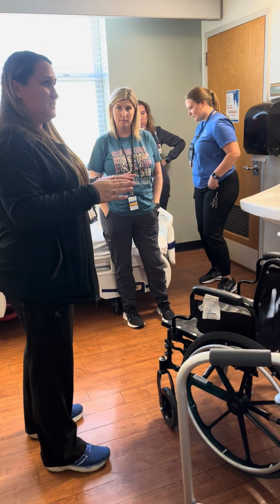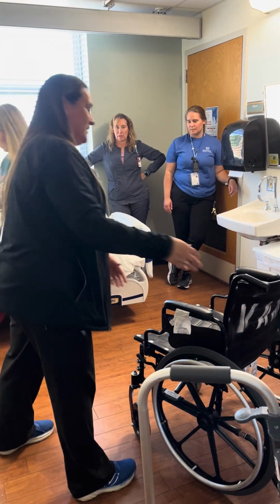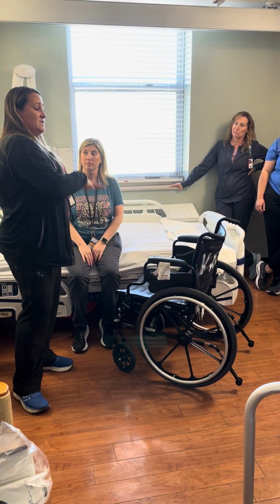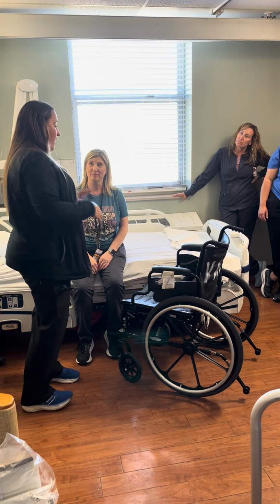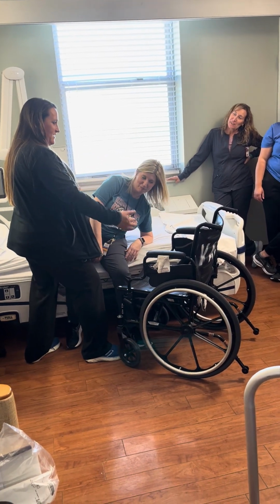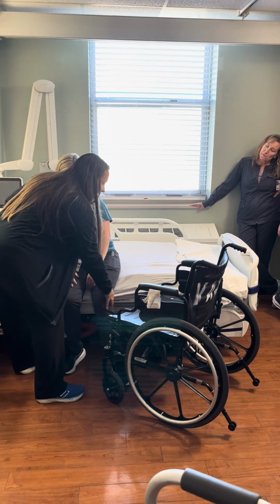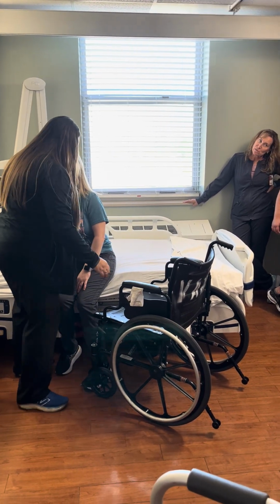To talk about here, I'm just going to do transfers really fast and go over, if you want to sit, setting up for a stand pivot transfer with the wheelchair at an angle. It's easier to go to the strong side, but you can't always go to the strong side. So if she's transferring over here to the weak side, you want her head and shoulders in the opposite direction.